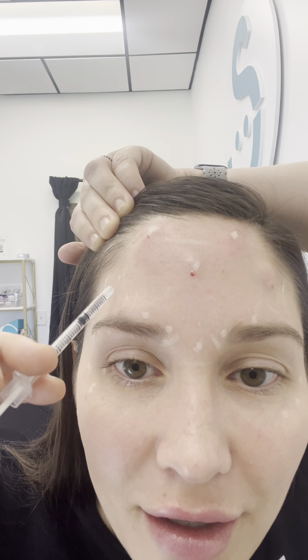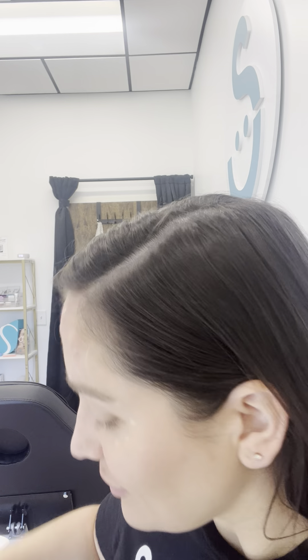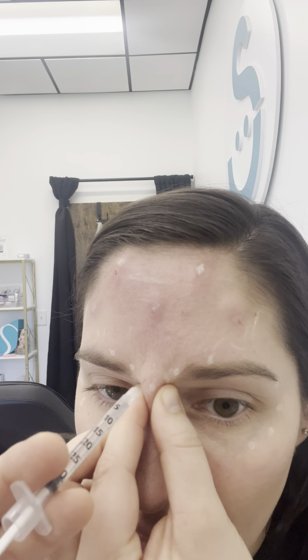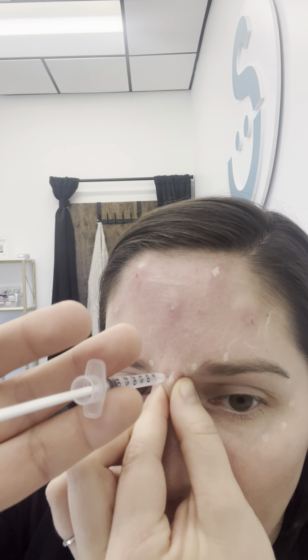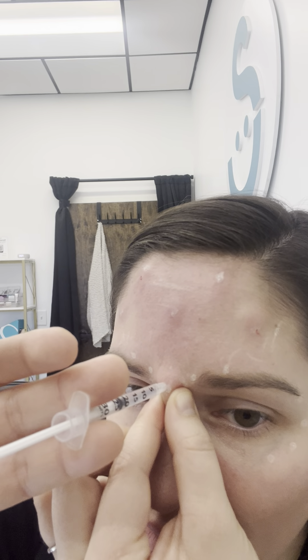So I did my eight-unit syringe on the frontalis and then my 12-unit syringe, which equals 20 units total for that area. For the glabellar complex I do the opposite — I start with my 12-unit syringe. I do my procerus first at 90 degrees, nice and deep. This is difficult to do to yourself, especially with filming.